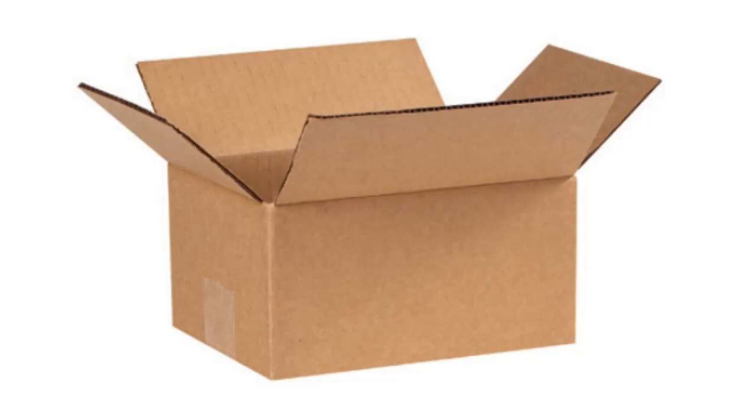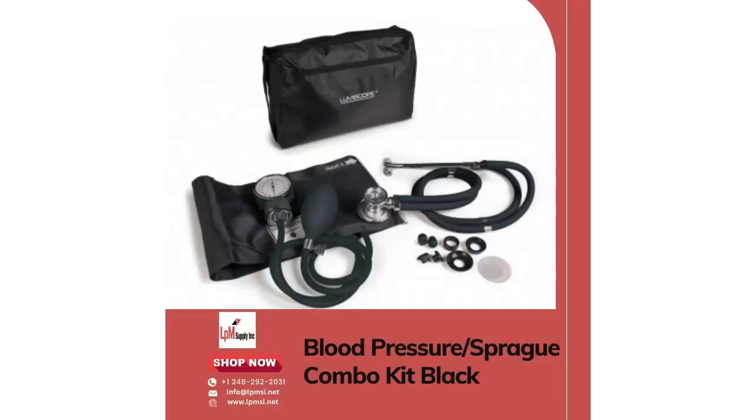The aneroid sphygmomanometer blood pressure and Sprague combo kit is available in different colors, allowing healthcare professionals to choose the option that best suits their preferences. With its high quality construction and convenient features, this kit is a must-have for any medical setting.